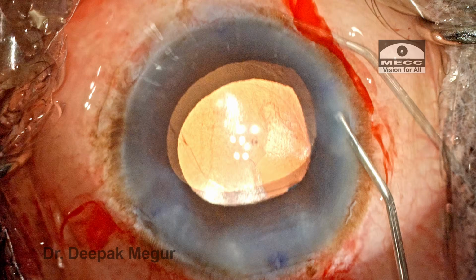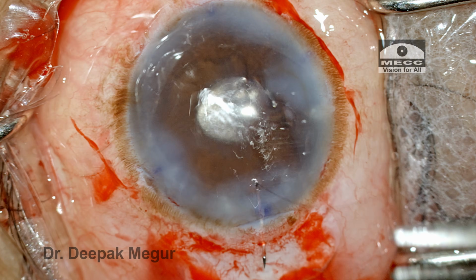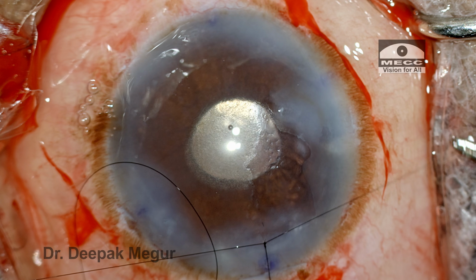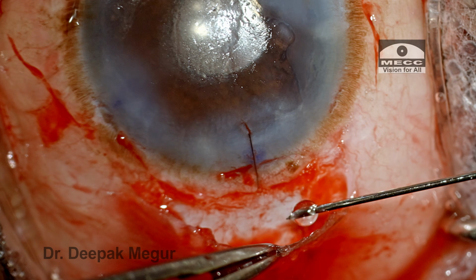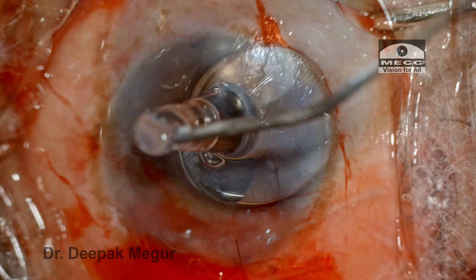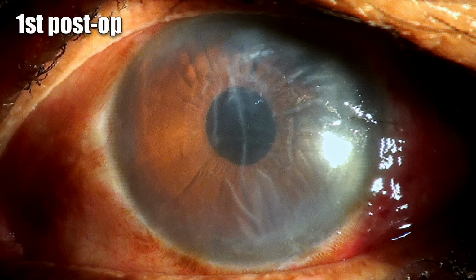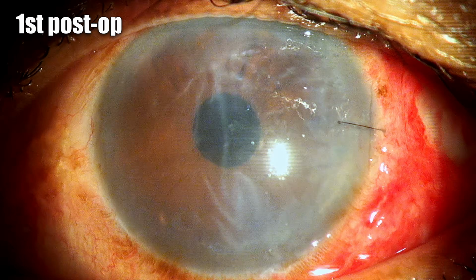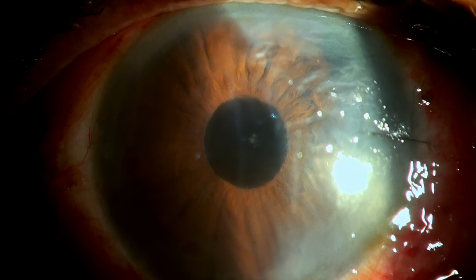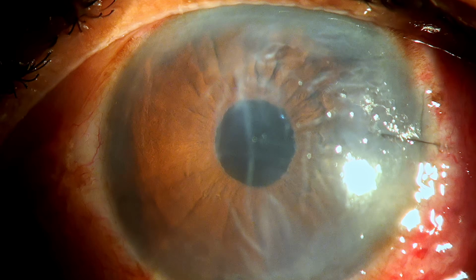The side ports are hydrated. Because the eye is softer post-vitrectomy, I would like to close the main incision using a 10-0 nylon suture. The conjunctiva is closed using glue, and this is the end of the case. Now, these are the first day post-op pictures. The cornea is edematous. However, the chamber is deep. There is not much of an anterior chamber reaction as such.